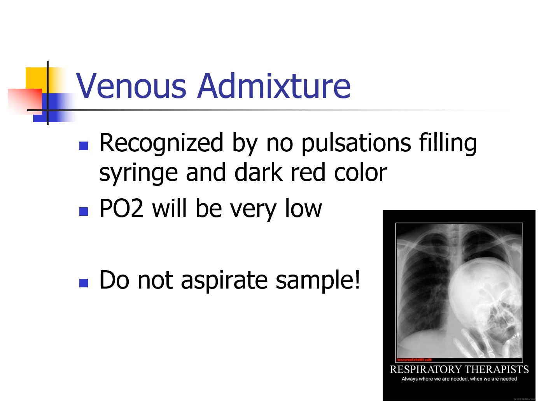The PO2 in this blood gas is going to be very low. If you hit an artery, even on a patient that's hypotensive, like someone that we're doing chest compressions on, CPR on, you still do not need to aspirate. You do not need to pull back on that syringe. You still should have adequate pulsing, even with compressions, that should fill it up with pulsing. So if you have to pull back, odds are you are in a vein, right? And so that's not something we can use. That's a whole big thing.